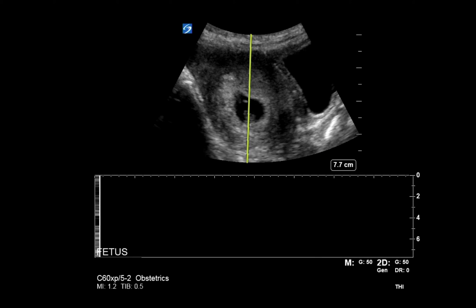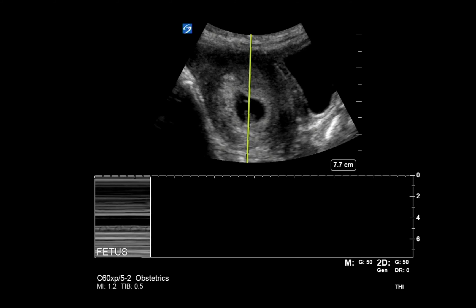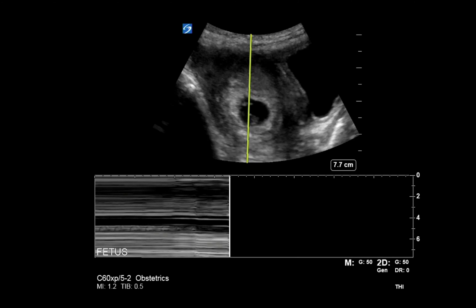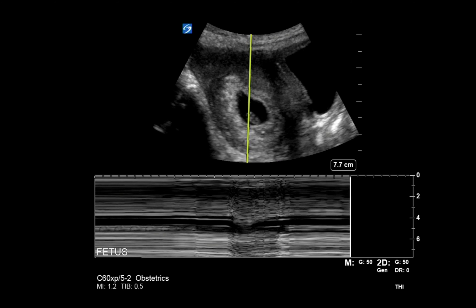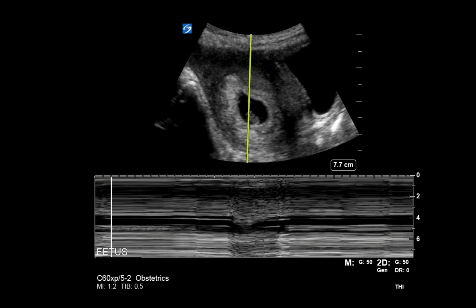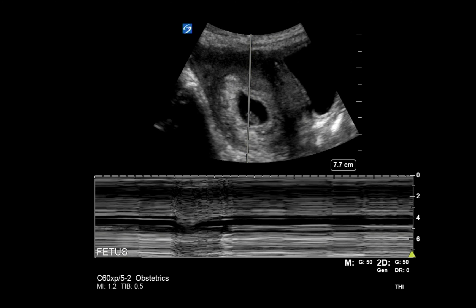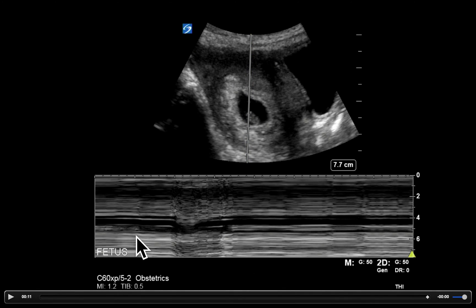Another issue you can run into is that as you're trying to do this, you may slip off the area, the patient may move, or you may just slip. Fortunately, we'll be able to see live video — though not all machines are set up that way. What we can see here is that initially we're on target, then we slightly slip off and we're no longer over the fetal heart rate. When we freeze this we don't really have a usable line or complexes to measure a fetal heart rate.